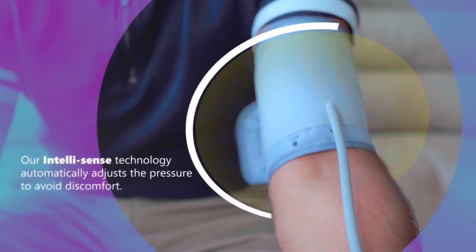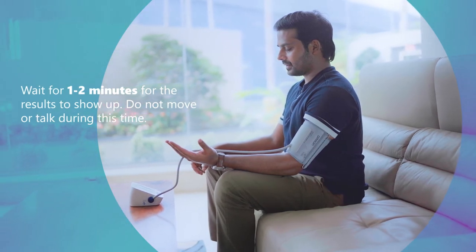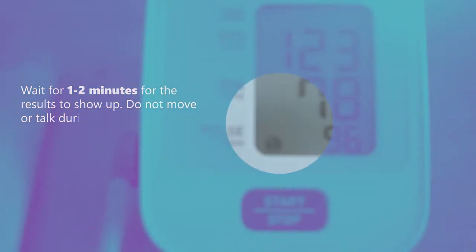Our IntelliSense technology automatically adjusts the pressure to avoid discomfort. Now you just have to wait a couple of minutes for the results to show up. Do not move or talk during this time.